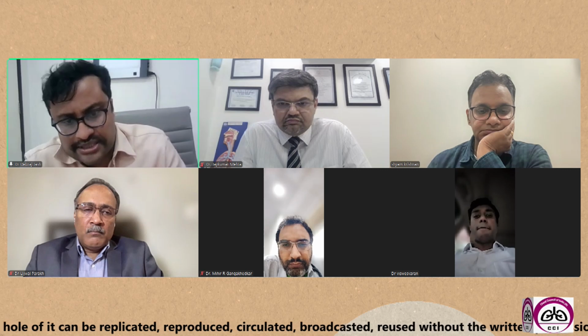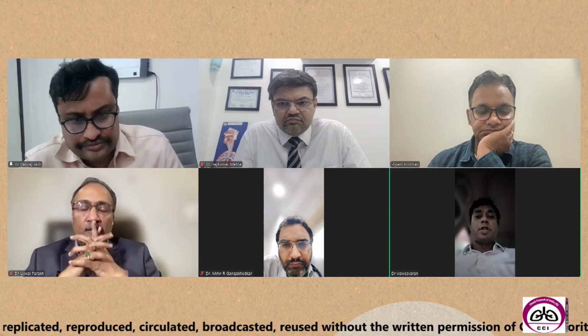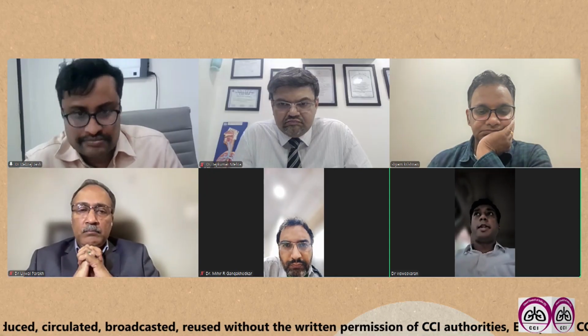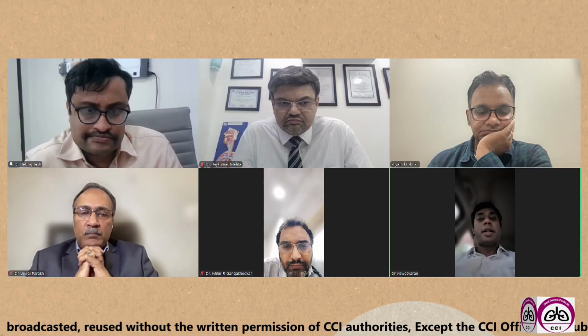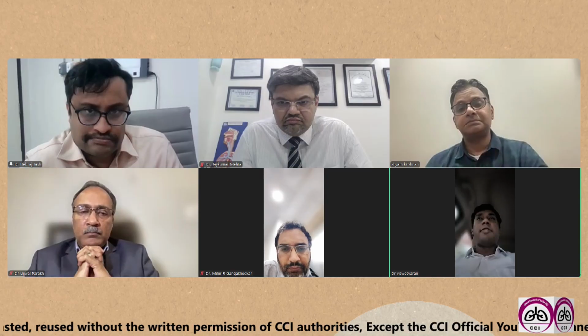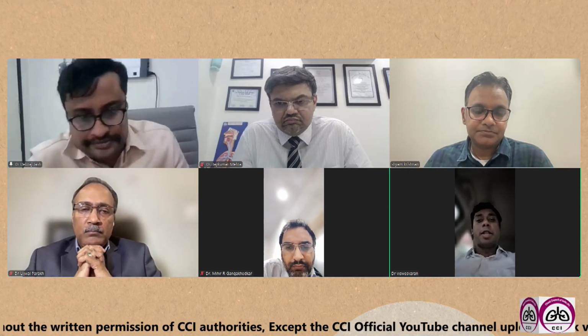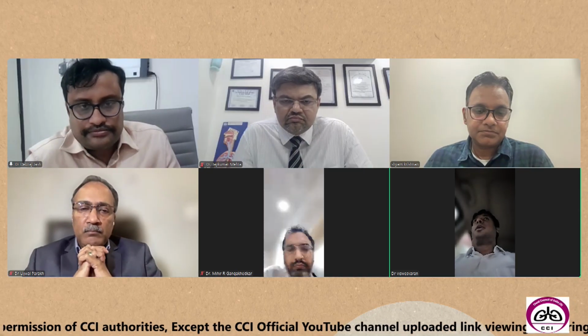Which antibiotic will you recommend, sir? It's generally a third generation cephalosporin. Third generation cephalosporins generally is what we give. But to be very honest, there is no proper guideline recommendation also, because ideally this is not indicated for the cyst only. You do it very rarely, when you are doubtful whether it is a cyst or a necrotic space or something like that, and then you realize that you actually aspirated a cyst.